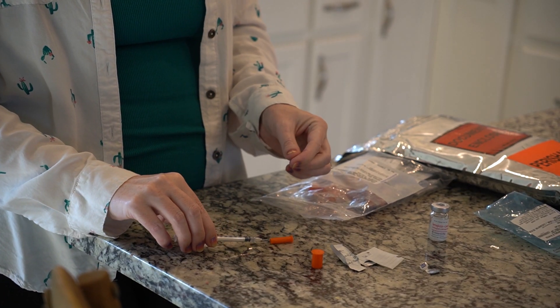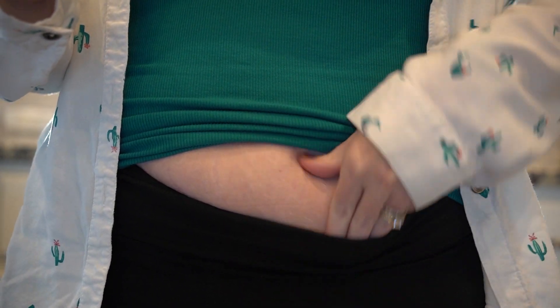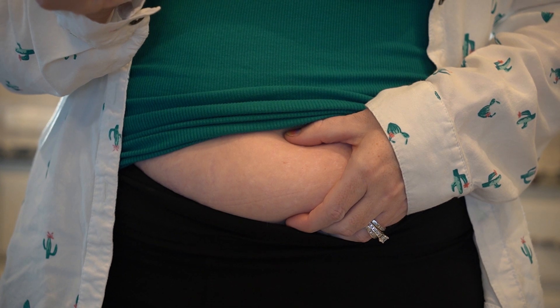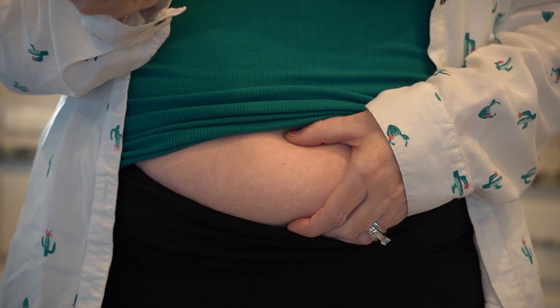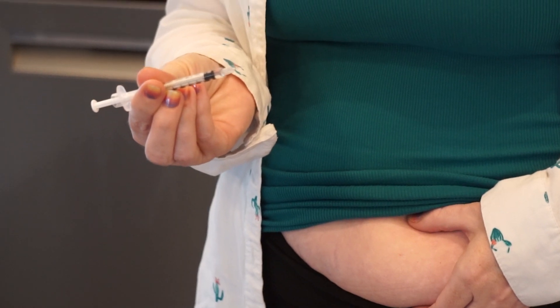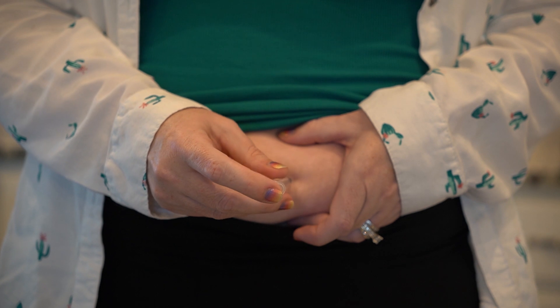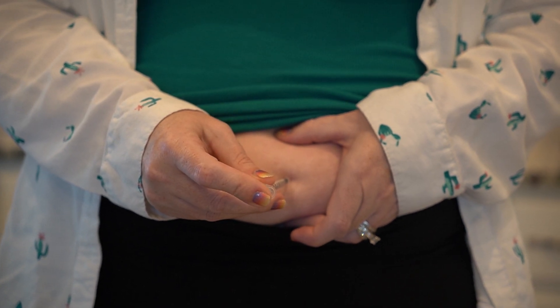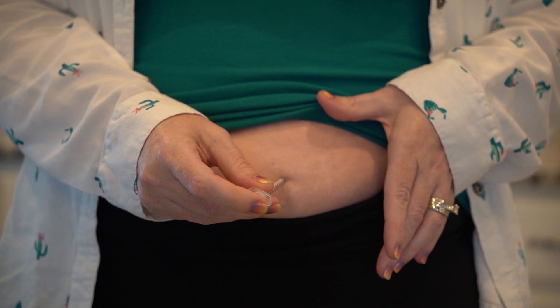After your skin is dry, remove the syringe from the cap. Then hold the syringe in your dominant hand. Use your other hand to pinch a one-inch fold of skin. Make sure the angled or beveled side of the needle is facing up. Then with a quick and smooth motion, push the needle into the skin at an angle between 45 and 90 degrees. Release your skin and begin injecting the medication by pushing carefully and slowly on the plunger at the end of the syringe.